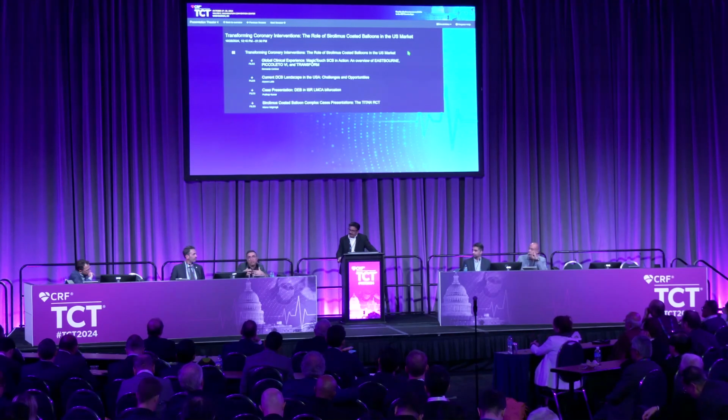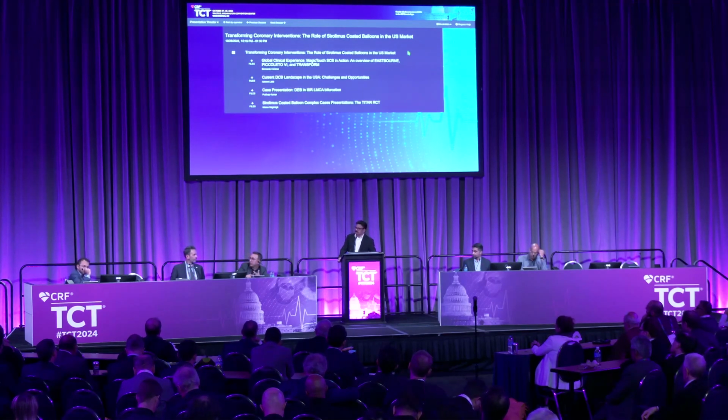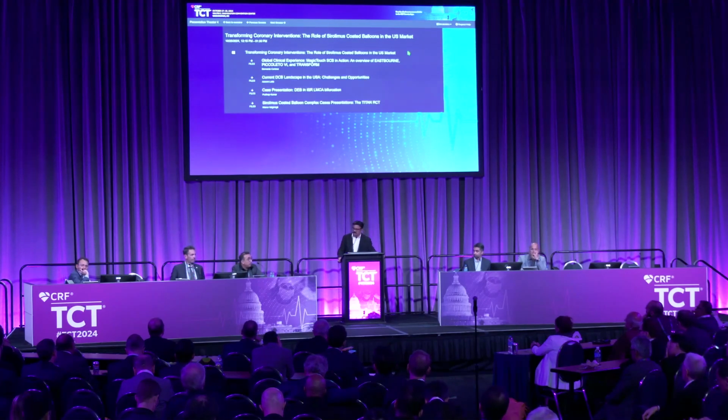I mean, one of the things we need worldwide is better use of intracoronary imaging. I'm hoping now with the new European guidelines, where for the first time we actually have a class 1 indication to use intracoronary imaging for complex lesions, bifurcations, restenosis, left main. I hope that encourages a lot of you that there's a lot of data to support using it. It will make you a better interventionist. So we're hoping that in MAGICAL we'll get 80 to 90% intracoronary imaging.